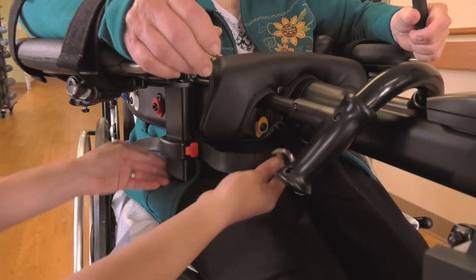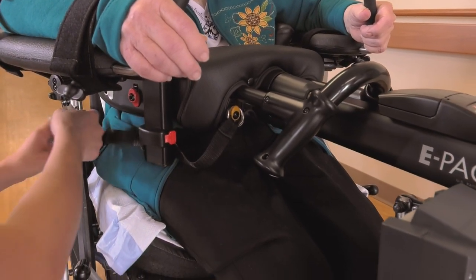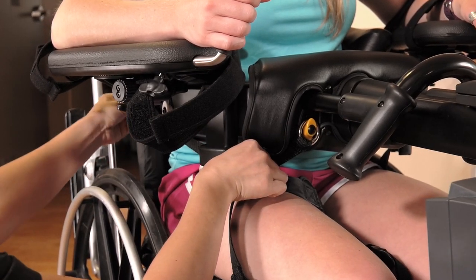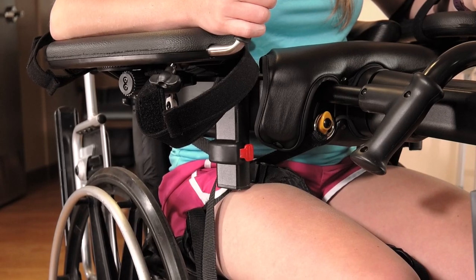For most patients with hemiplegia, either the red or the yellow hooks will work best. Tighten the straps until there is minimal slack. Wrap the inguinal straps around the thighs and across the rear straps and connect them to the blue or gray clips. Tighten the straps.